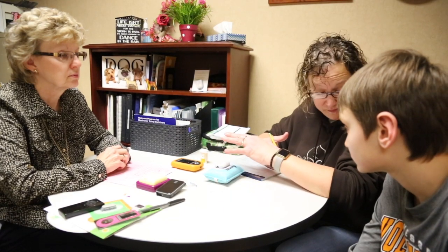Sometimes insurance companies will say, until you try this one first, we want, just like before you can take a pump, you should, for 6 months, try managing the diabetes on your own. There may be some other requirements, like before you can go to this new type of pump, you need to try this first. My experience is that they'll say, we don't cover this. So then we have to start here, and then they decide that they will cover it. So you still want to go for the pump, even if it's not the exact one you wanted.